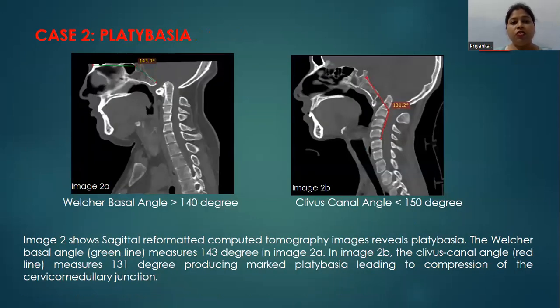These images demonstrate platybasia. In image A, the sagittal reformatted images show the Welcher basal angle measuring 143 degrees. In image 2B, the clivus canal angle measures 131 degrees, producing marked platybasia leading to compression of the cervicomedullary junction.